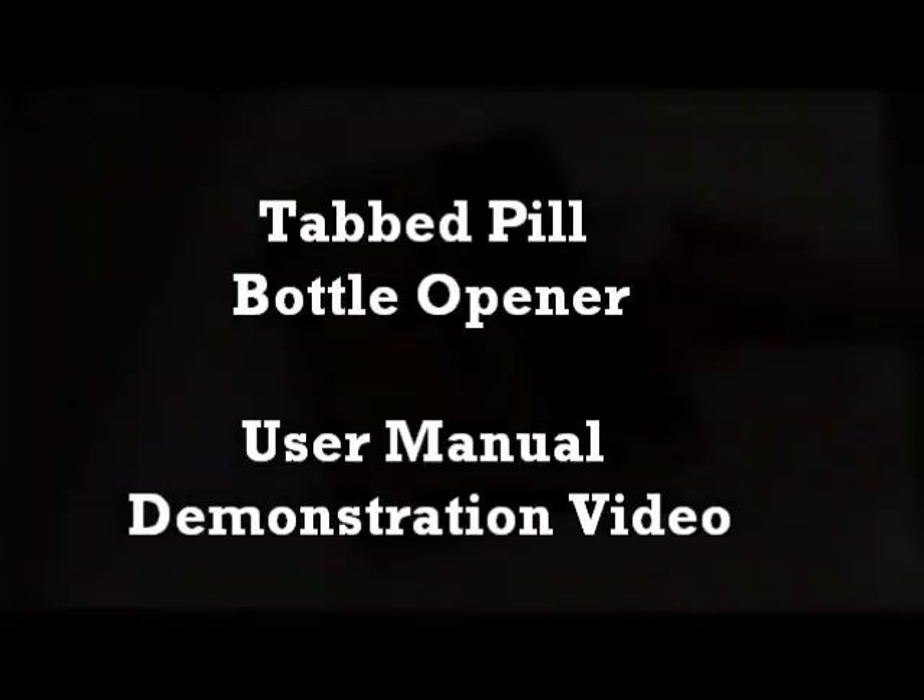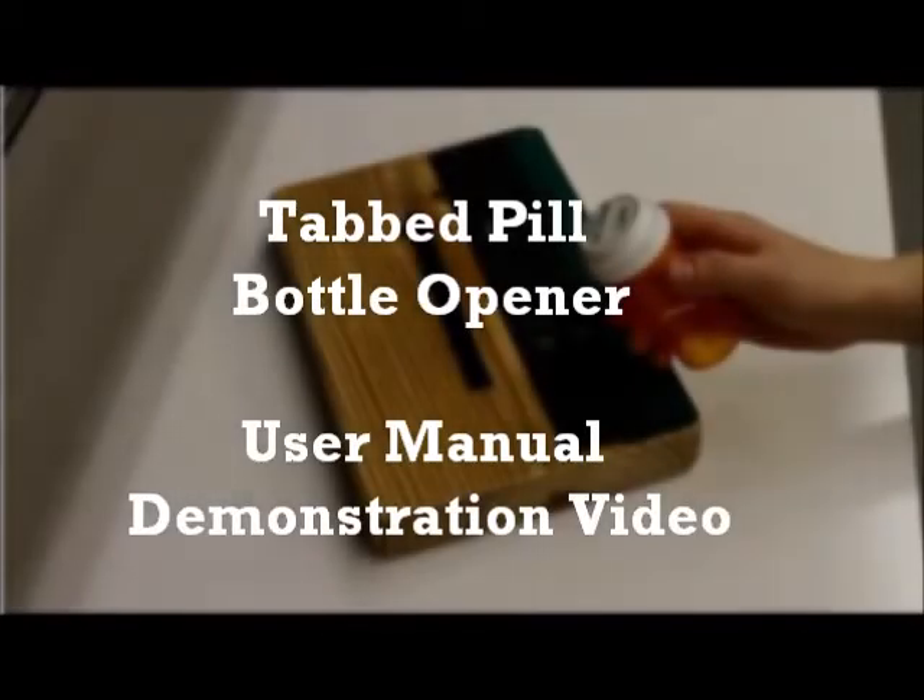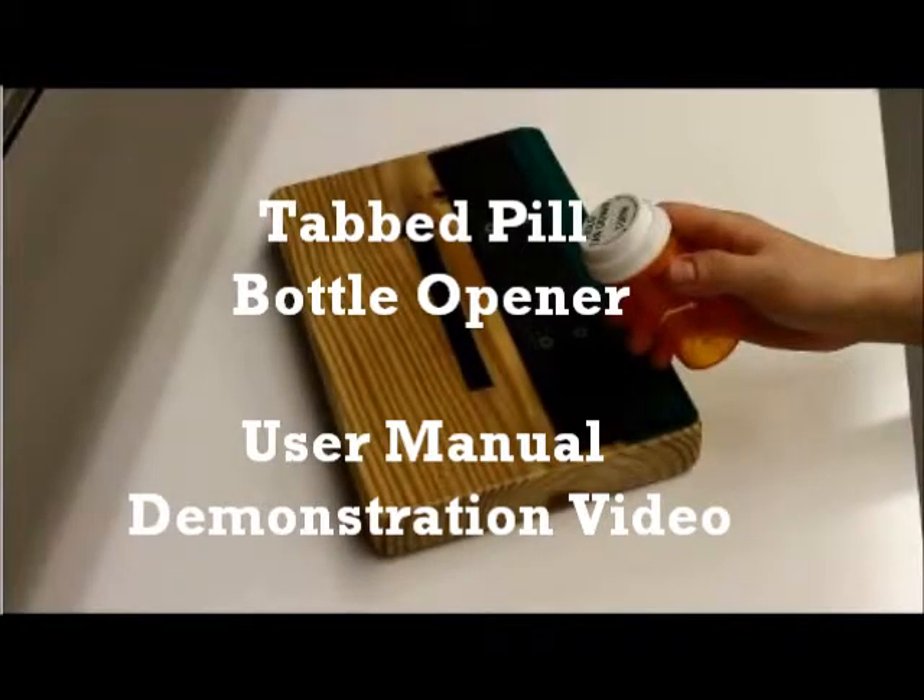In this video, you will see a demonstration of the tabbed pill bottle opener that can be easily used with one hand. For demonstration purposes, you will first see the video in slow motion, followed by a real-time example.